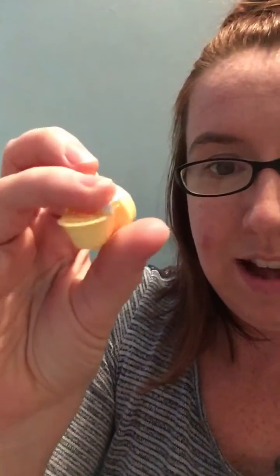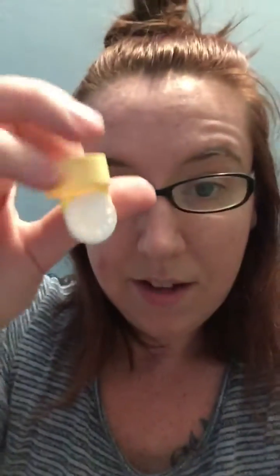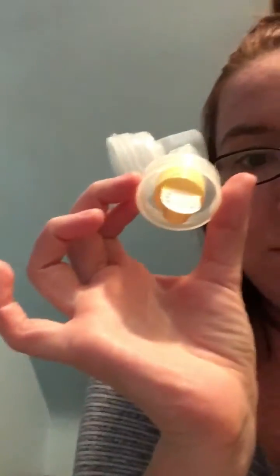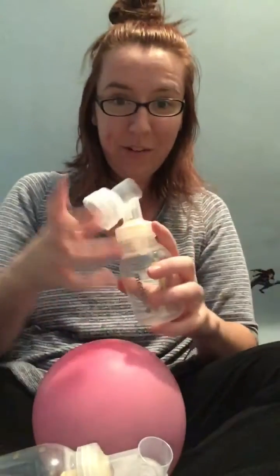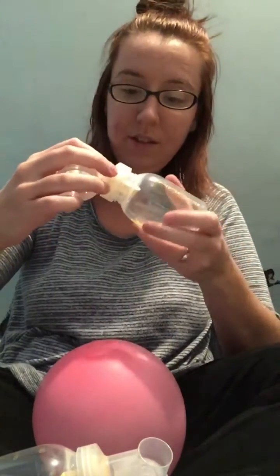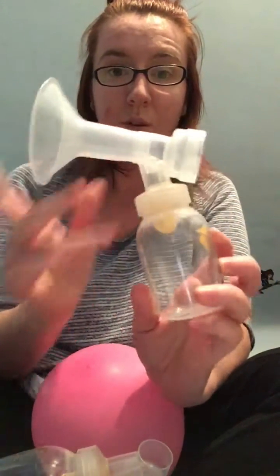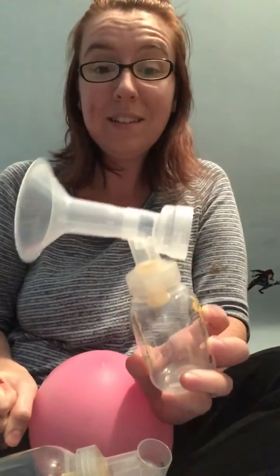Alright, so all you do is you take the membrane and you put it right there in the valve. It's got a little notch and it sticks right on there. Then you take the valve and you put it right here on the end of the connector. Just like that. Fits together pretty easily. And then all you do is screw it into your bottle. I'm going to set this up right here. Let me do that. Perfect. Okay. And then you just screw this all together. Take your breast shield and stick it into the end. Boom. Like that. It's pretty simple.